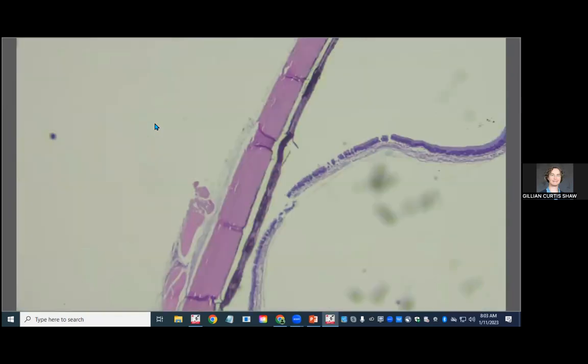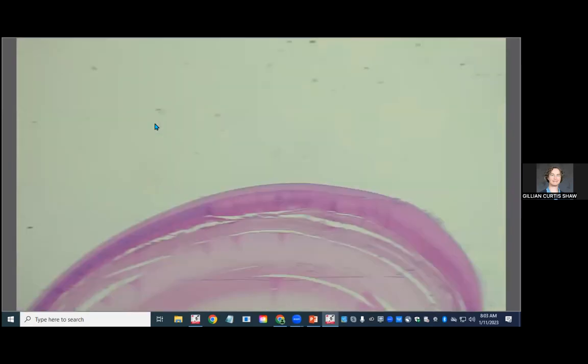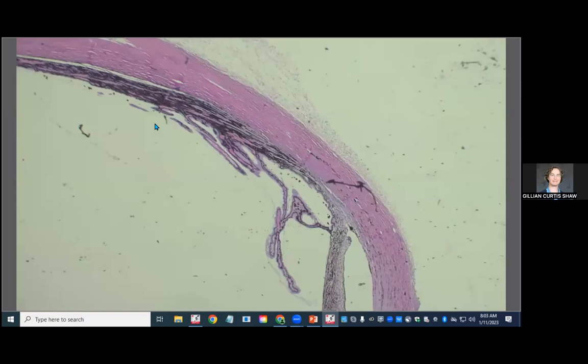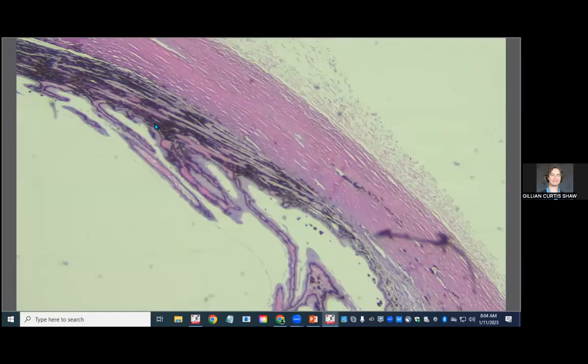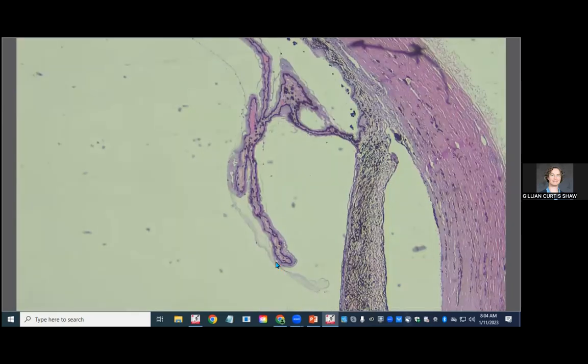So there are really only a few things that I want you to see here. Let's start by looking at the ciliary body plica, because it was the only thing we saw on gross. So we've got this wispy material that's slightly eosinophilic that you can imagine might have corresponded to what we saw grossly. And then in some places that wispy material is more condensed and multifocally adhered to the ciliary body itself at the non-pigmented epithelium.